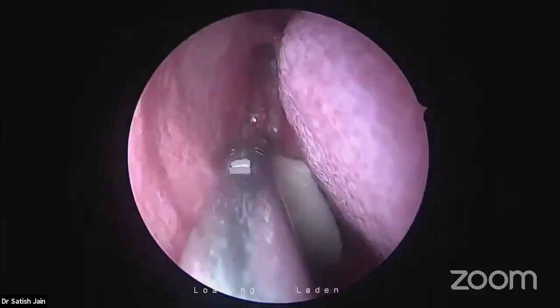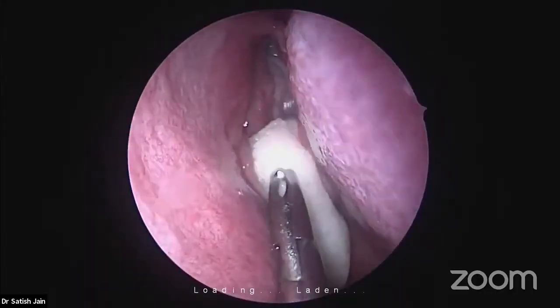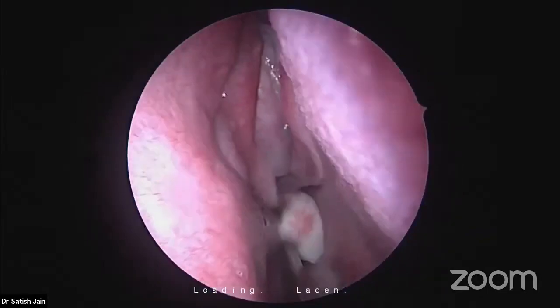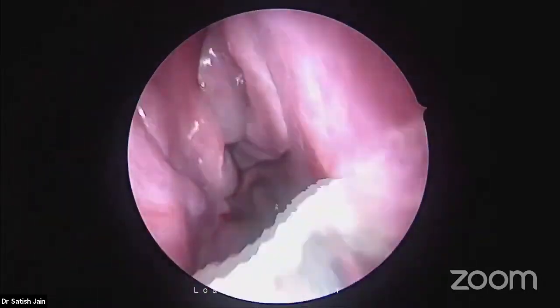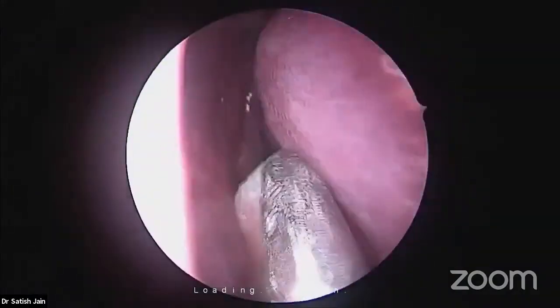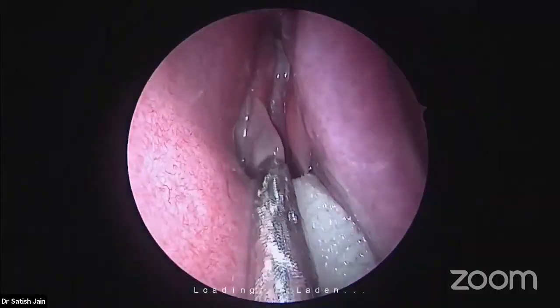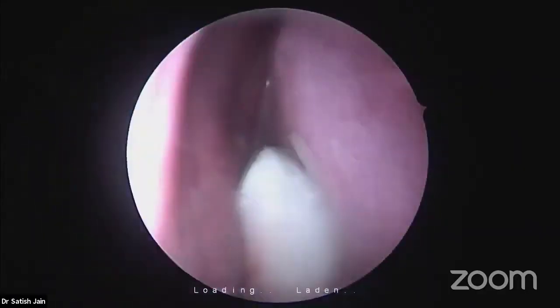But now, with the advancement in anesthesia technology, with good prevention of vasodilatation. Local anesthesia's another advantage was that you can reduce the vasodilatation, which is one of the reasons for more bleeding. It was supposed that overall bleeding is less in local anesthesia as compared to general. But now with the advancement in anesthesia technology, we can have a better field under general anesthesia, number one. Number two, you can more freely use the powered instruments.